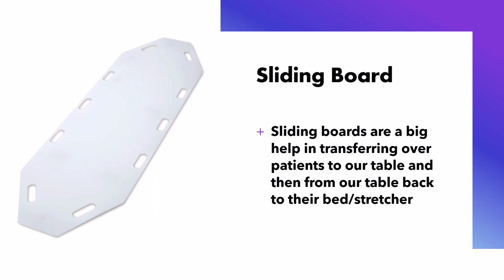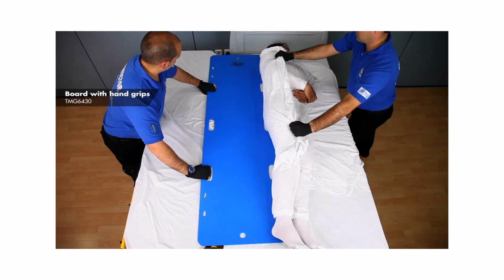Sliding board, oh my gosh. I don't know why it took us so long to invent these. There are hard plastic boards with hand grips, and you roll a patient and you slide this under, and then you can easily slide even a large patient. You can take the whole board or slide the patient across the board to move them from one table to the other. You would see that the emergency personnel use these also.